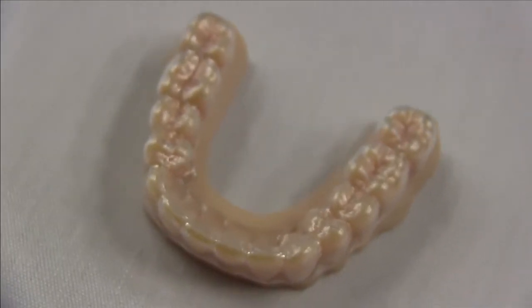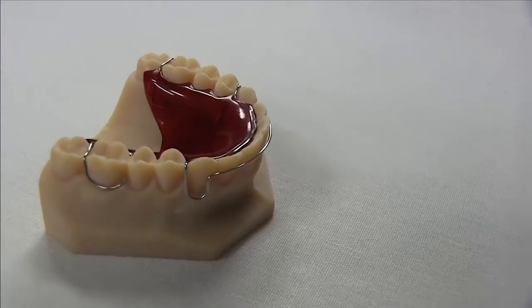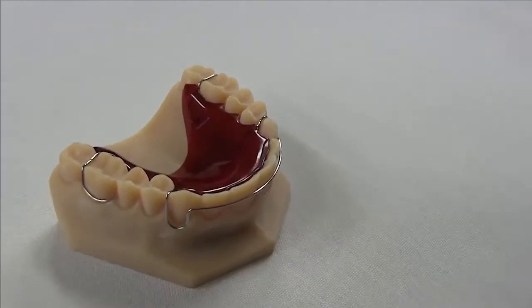With the digital process, the main application is that the doctor scans the patient's teeth and gums and sends us an STL file of the patient's teeth. When we get that STL file, we print out the patient's teeth and gums and then we make the product on the model.